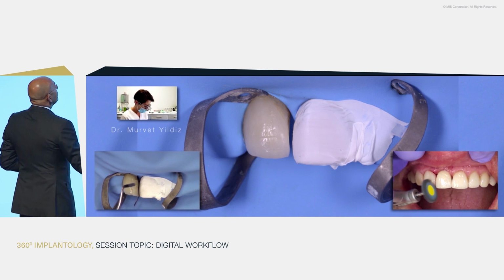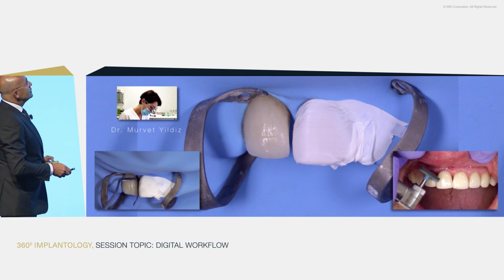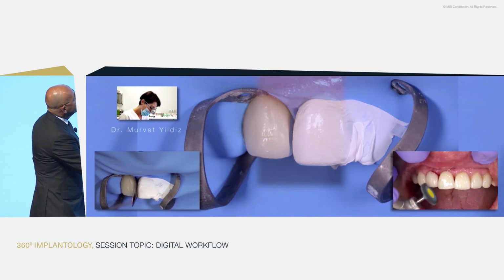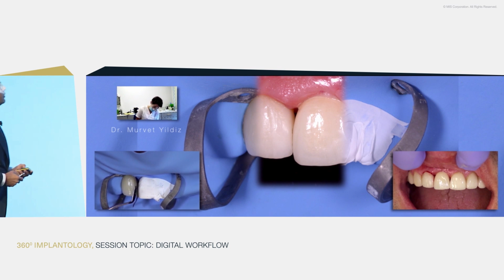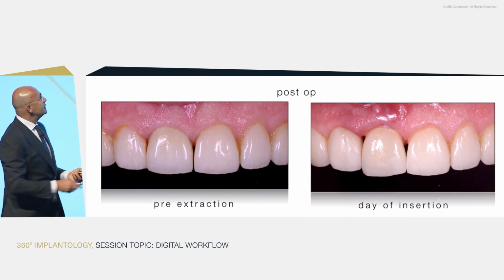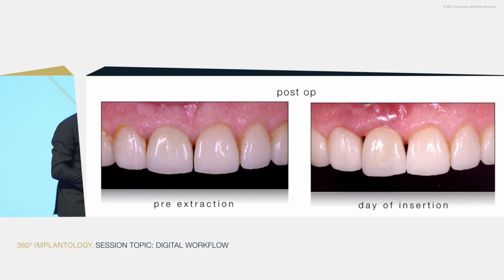Just after that, Mürvet, one of our sweet associates, is placing a composite over here, and you can see this space has been easily closed with a composite. So with that, when I bring it back, this is how we started, and this is the day of insertion.